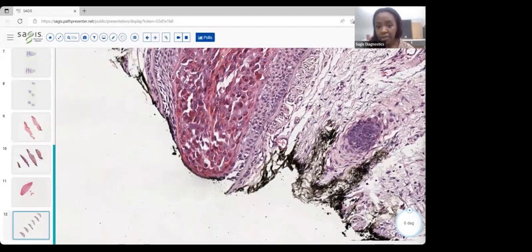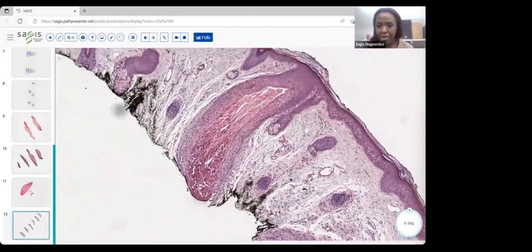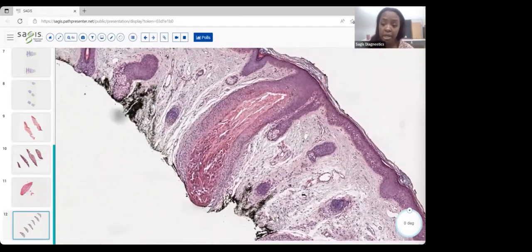And the particular virus is thought to be polyomavirus. The person that you're going to see this in is typically an individual who's had a renal transplant, or a transplant of some kind, but more often renal, or they may be on cyclosporin. It's also been described in the setting of cyclosporin use, or even just some other chemotherapy. So that's the kind of host or individual that you're going to see this pretty neat, unique diagnosis in.